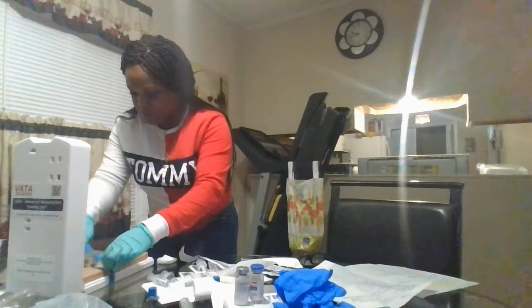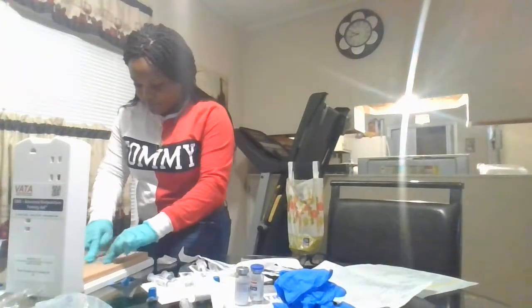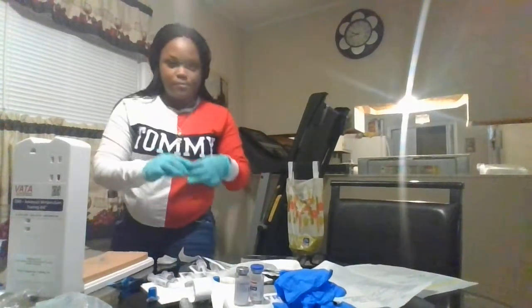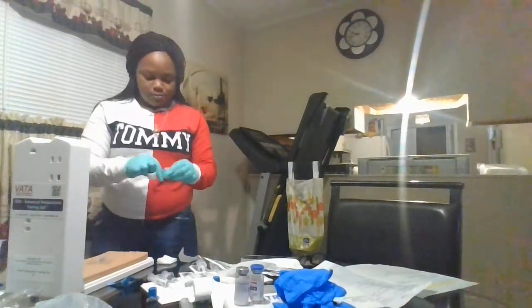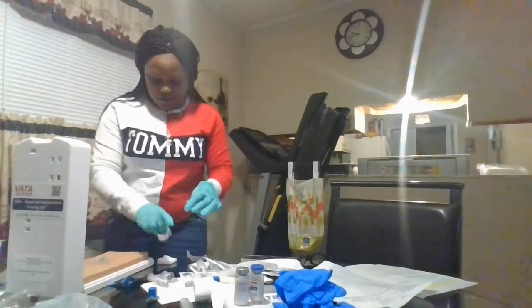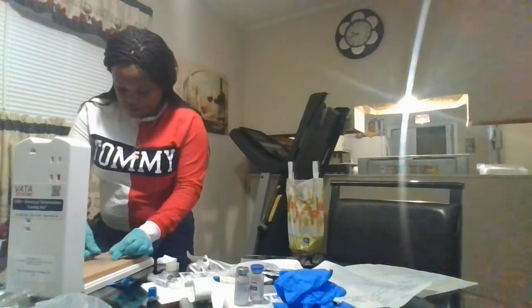All right, Mr. Jack, I'm going to remove the tourniquet. The pulse is still present. Okay, I'm going to secure with tape, by chevron. Tape on the hub.